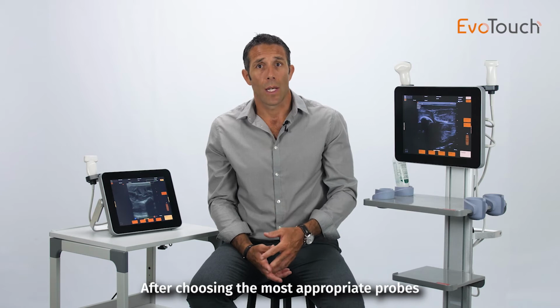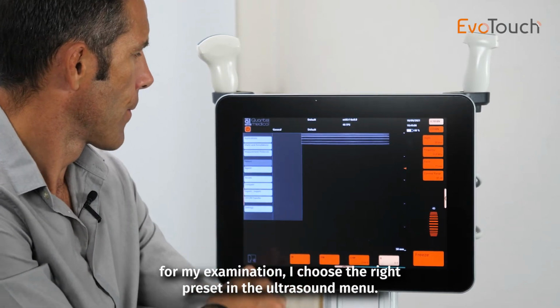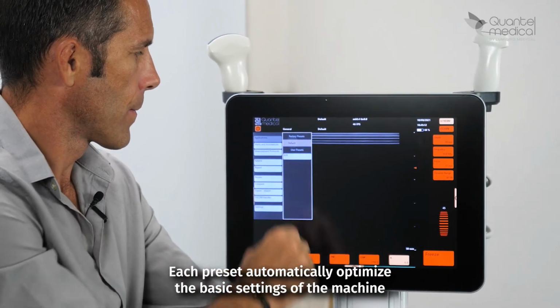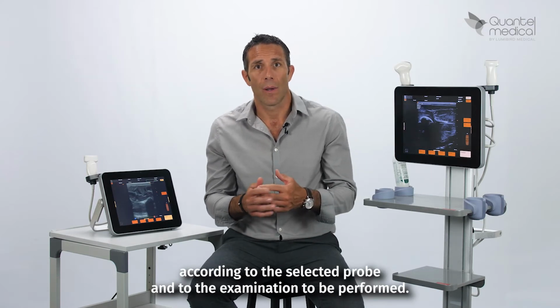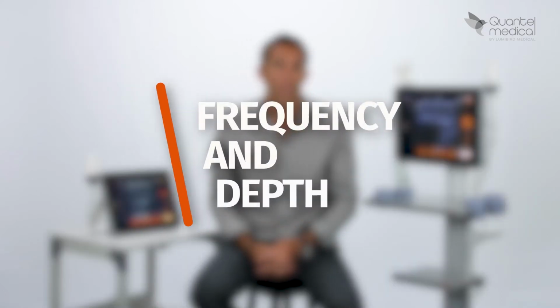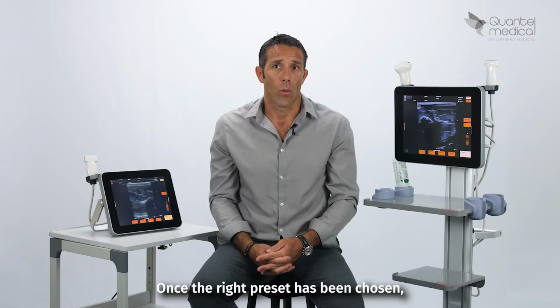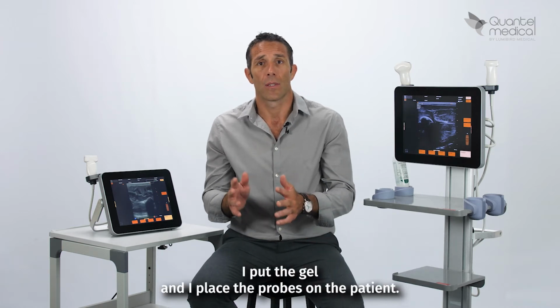After choosing the most appropriate probes for my examination, I choose the right preset in the ultrasound menu. Each preset automatically optimizes the basic settings of the machine according to the selected probes and to the examination to be performed. Once the right preset has been chosen, I put the gel and I place the probes on the patient.